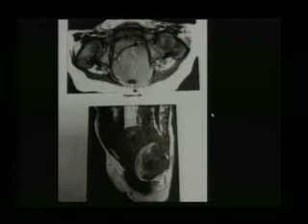Okay, Carson. We've got these two, and I've got one more image to show you. Axial and sagittal MRI at the level of the pelvis or acetabulum bilaterally, sacral to the midline. We have a mass involving the posterior elements and central elements of the spinal cord. I mean, of the vertebral column. So here's the sacrum, here's the coccyx. So it's anterior to it. Let me show you another one. Okay. So this is a 13-month-old girl with this pelvic mass. T2 fat sat, is that what it says? This is incorrect.